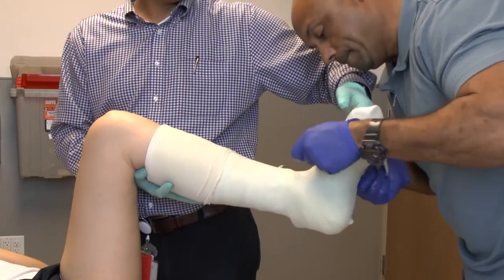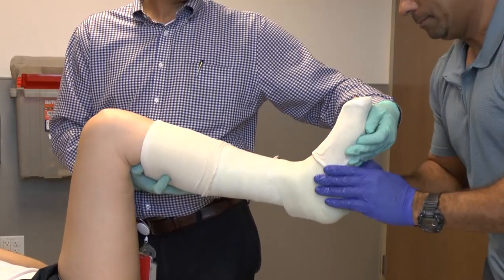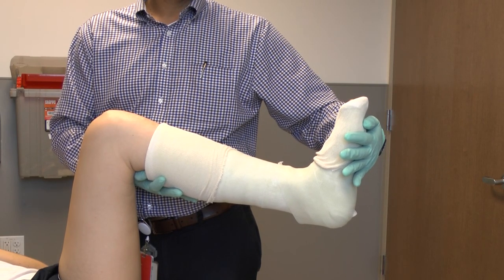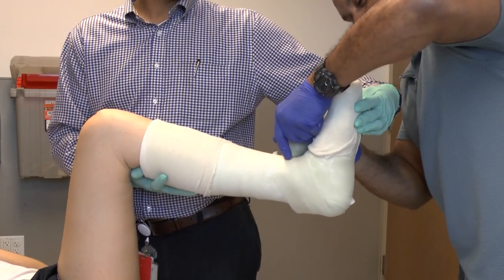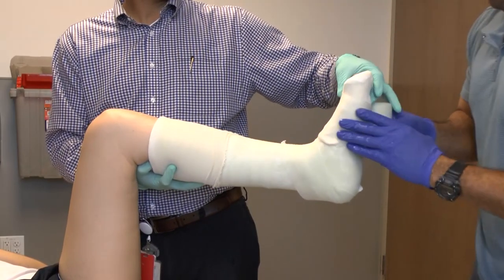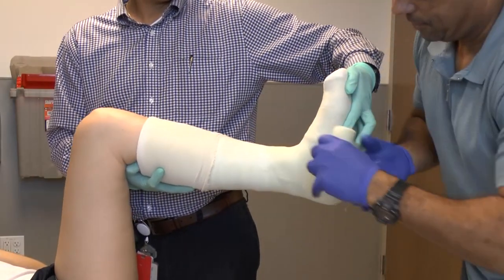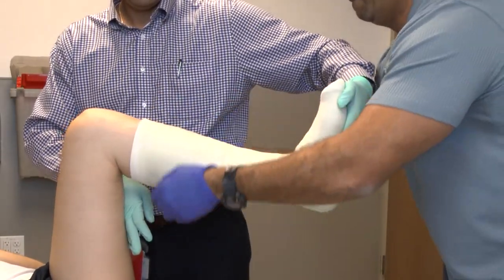With the stockinette pulled down into position, the holder can transition to maintain dorsiflexion of the foot. However, it is sometimes better to keep the fingers within the cast so they don't apply pressure to the bottom of the cast. The fiberglass then gets rolled over the lower stockinette to capture it, and then proceeds all the way back up around the ankle, being sure not to overdo the anterior aspect, finishing with oblique placement proximally.